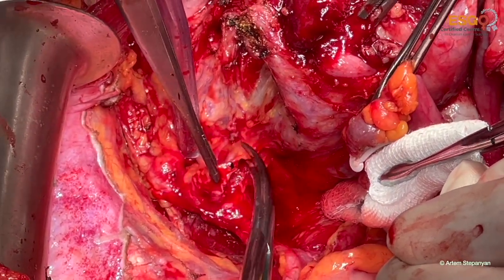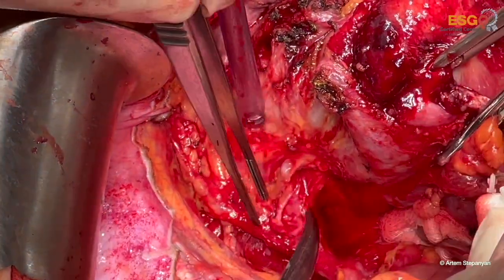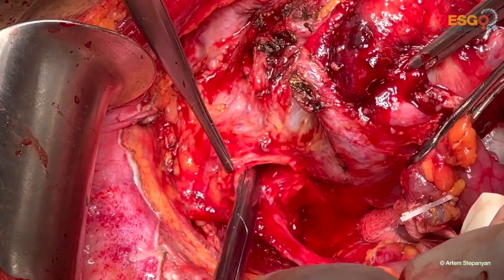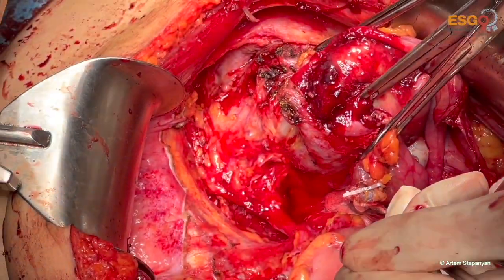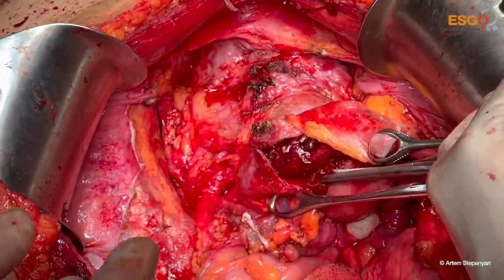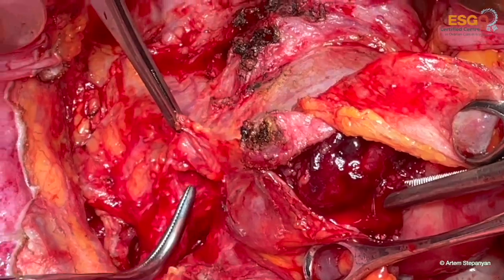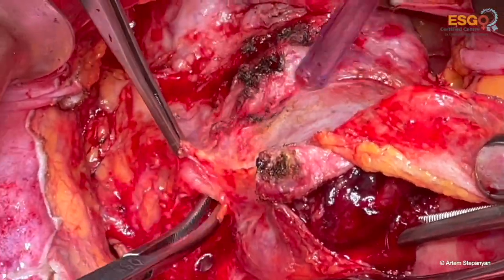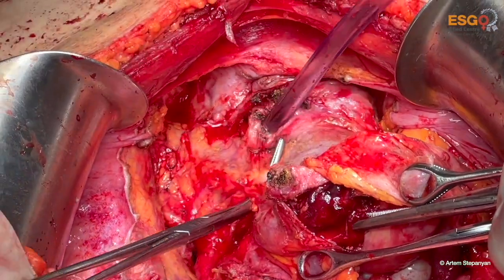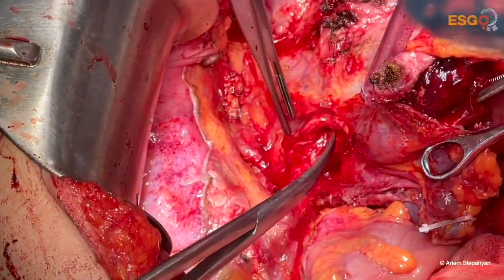You see that we mobilize the ureter, we tunnelize the ureter, trying to find the uterine artery. It's here. And now, once the ureter is tunnelized, we can separately cut the uterine artery or cut it together with the ureteral roof. It's not important because this is not cervical cancer. Our goal is just to visualize the ureter and to be safe.